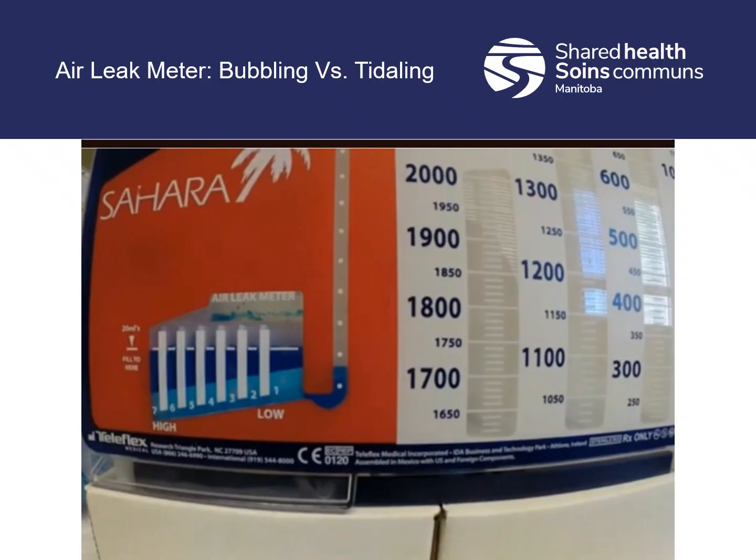So there's a difference between bubbling and tidaling. What we're going to see in this video now is tidaling. When you notice an intermittent pattern of bubbling that fluctuates with the patient's respirations, it's most likely that these pressure differences are coming from inside the pleural cavity.